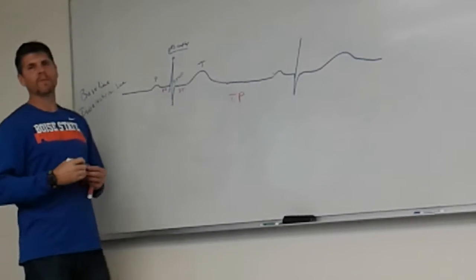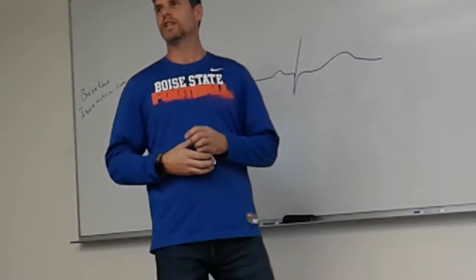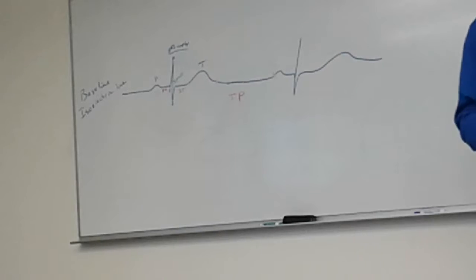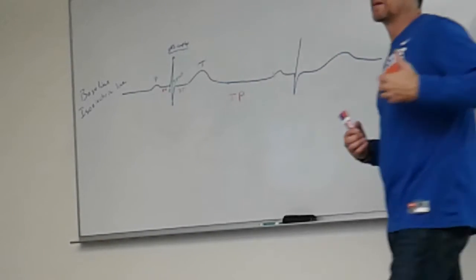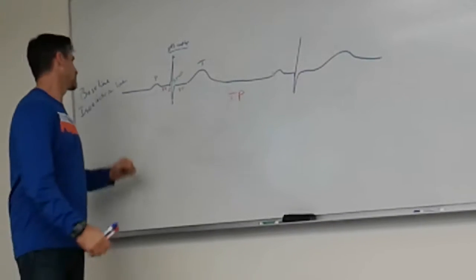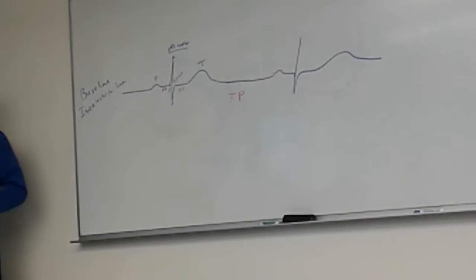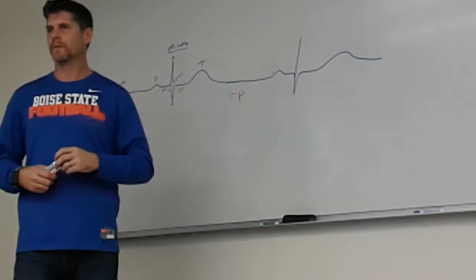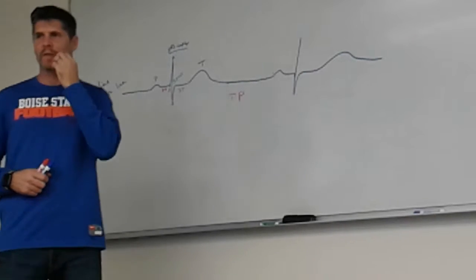I will tell you right now that I will often use those words interchangeably, and I don't necessarily have a rhyme or reason for why I'm using it. Or in my head, I probably do. If my mind is working in more physiologic terms, I'll probably use medical terminology and call it the isoelectric line. And if I'm speaking more in clinical terms, I'll probably refer to it as the baseline. It doesn't matter. They're completely interchangeable. Good? Baseline and isoelectric line.